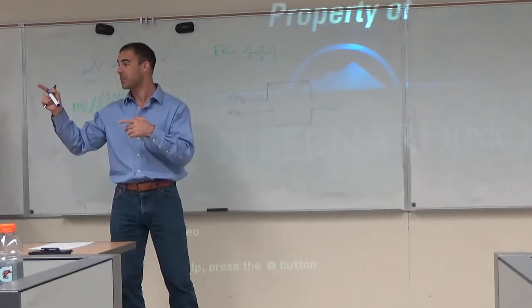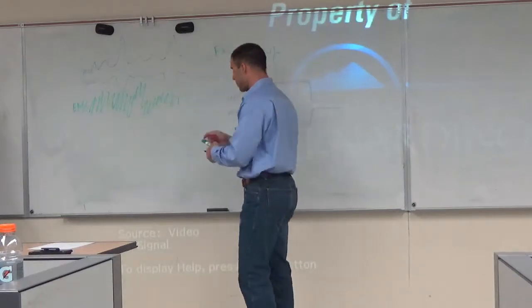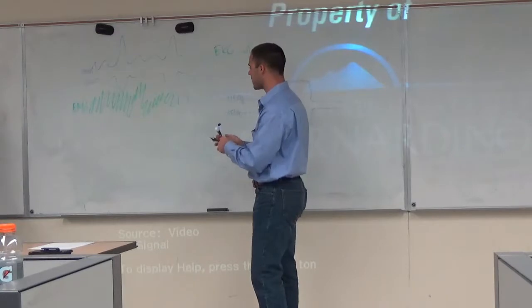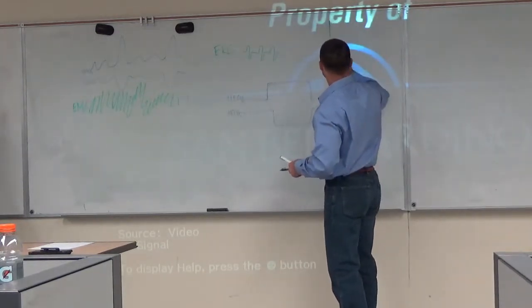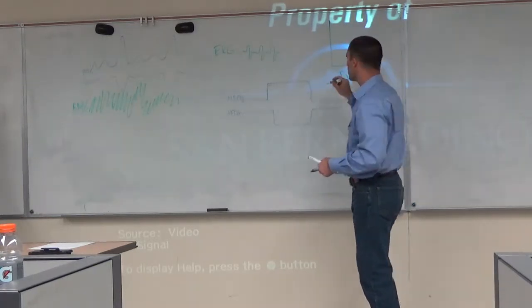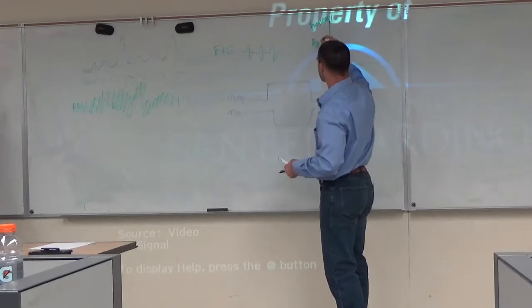Yes? I'm confused, what's alpha? Alpha is a frequency of activity. We talked about it a little bit last class, and it's in the text, but basically if you plot frequency over time, it's an easy way to conceptualize it. So here's your frequency, and we measure that in hertz.